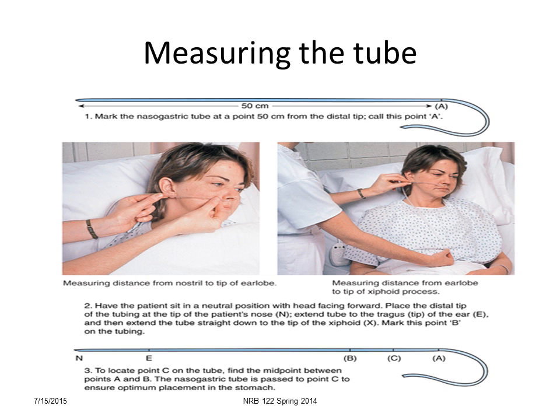The tube, I'm going to get into this more in class. I'm going to show you how we insert the tube, but it's very important that you measure the tube and use the specific guidelines of every agency that you work at.